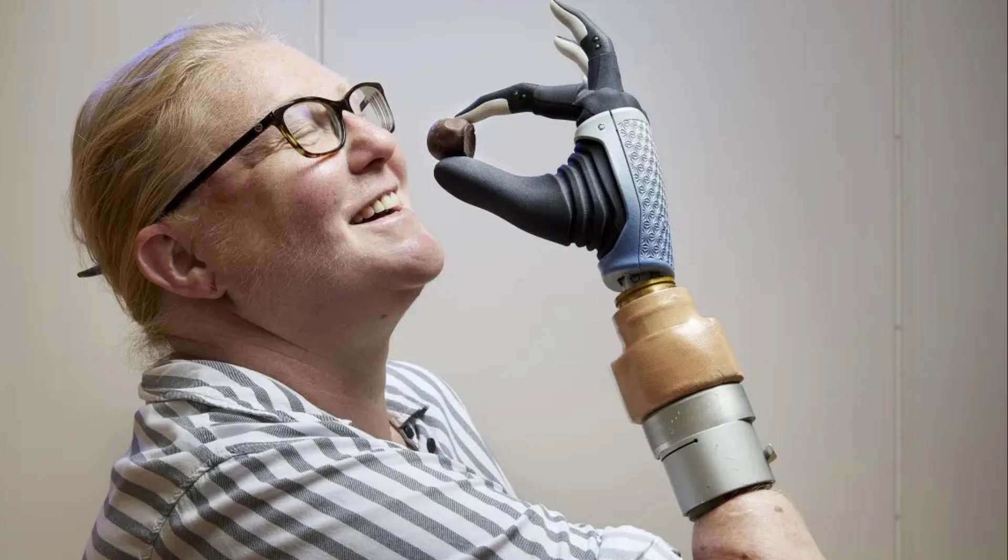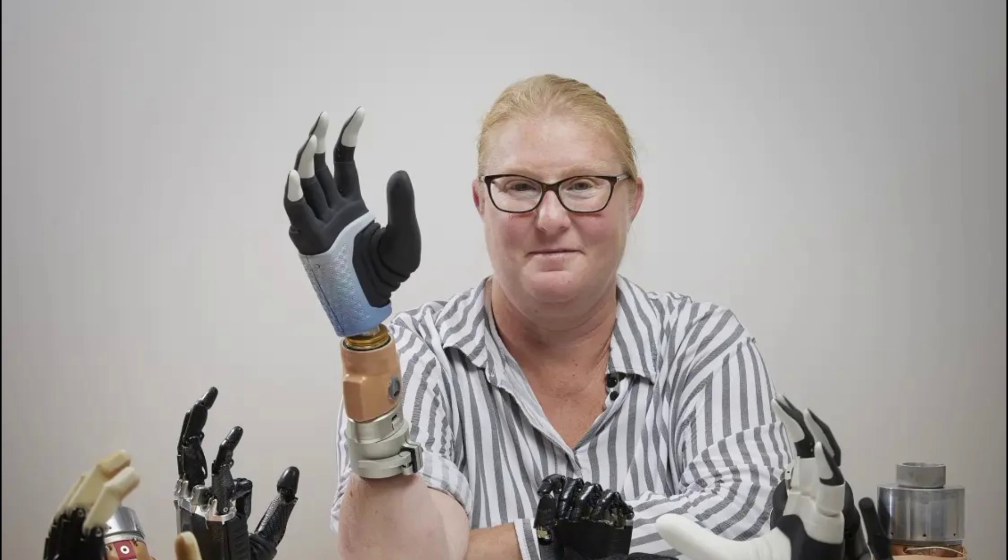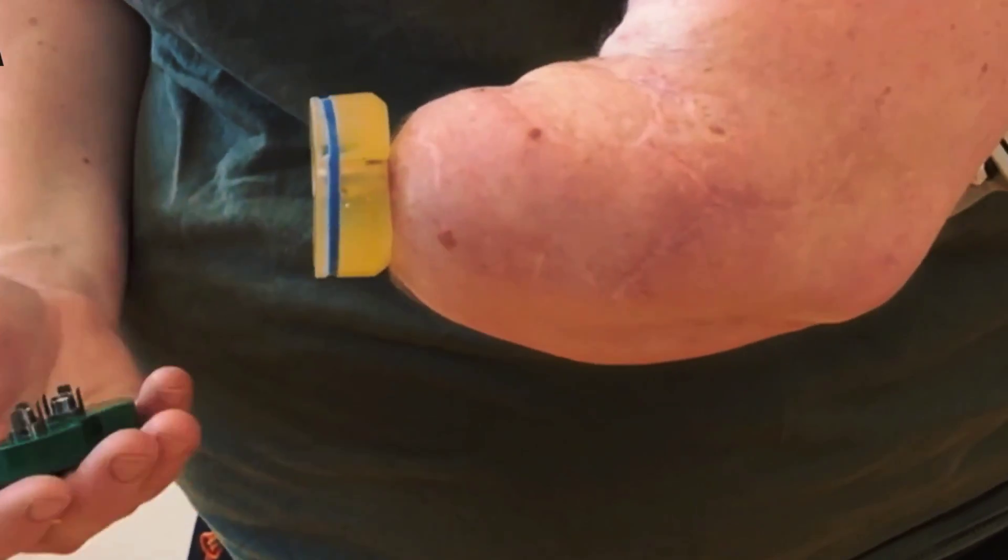She also feels some sensations in her artificial hand, such as warmth, coldness, and touch. She said, it's fantastic to feel something again with my right hand.